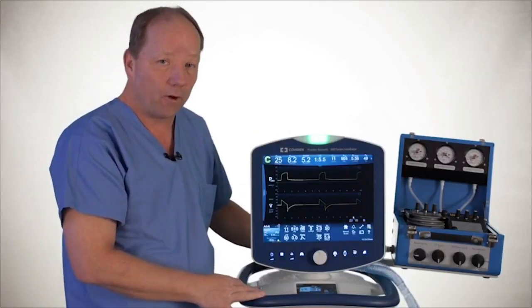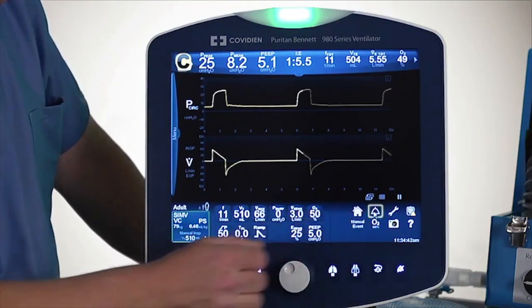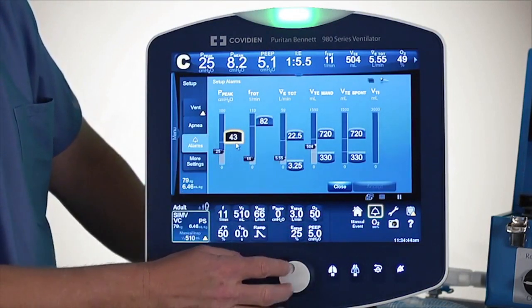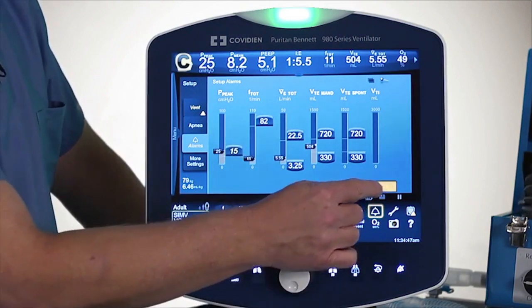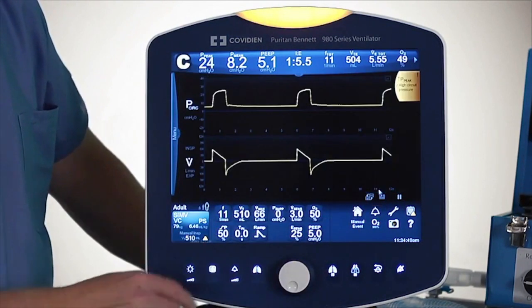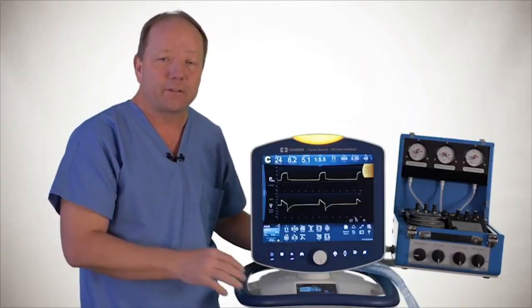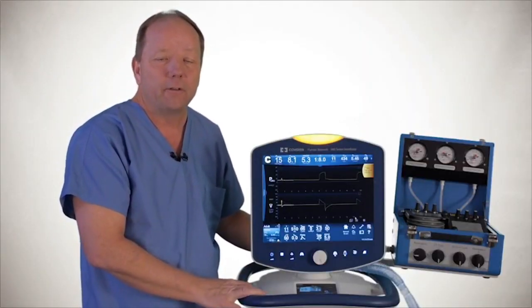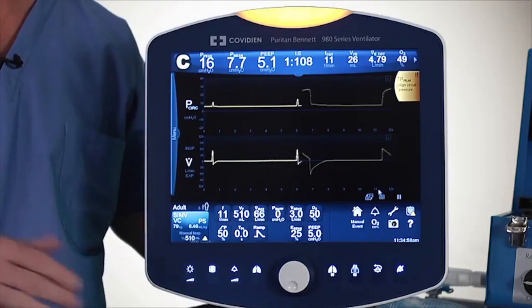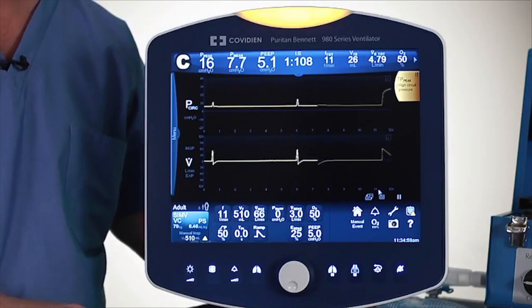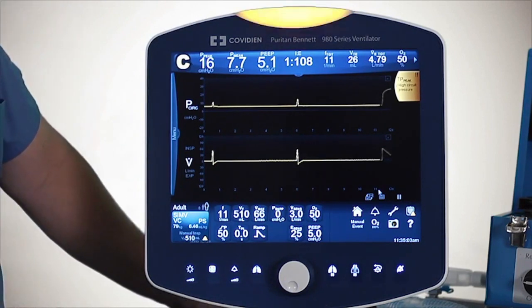Now let's simulate an alarm and listen to the three different tiers of alarms that can go off. I'll go back into my alarm screen. The first two-tone sound is the lower priority alarm sound. If that alarm continues, it will escalate to a three-tone sound.